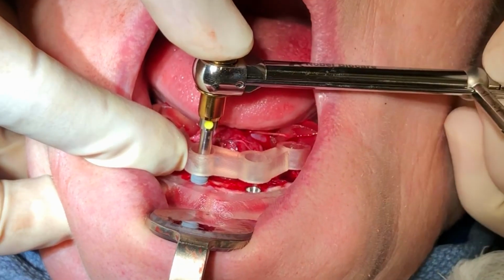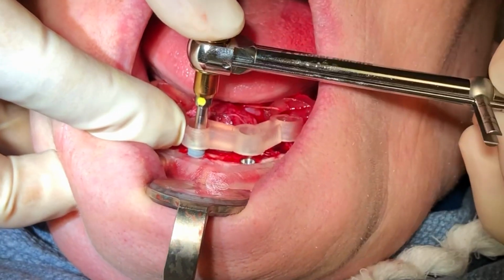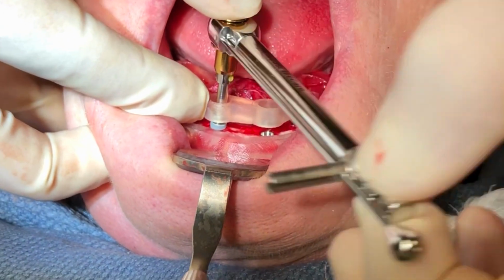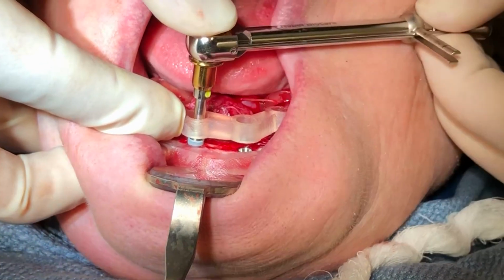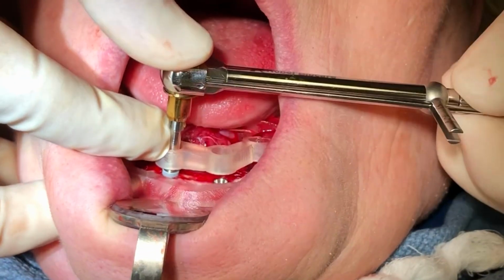And this is crucial because this is going to give you the answer to a simple question. Am I able to immediately load this implant? And if you want to immediately load, my recommendation is to be around 50 to maybe 70 newtons. Anything less than 50 in my office is not going to be immediately loaded. I'm going to probably most likely place just a healing abutment, and I'm going to wait a couple of months based on that primary stability that I accomplished in my patient while I was placing that implant.